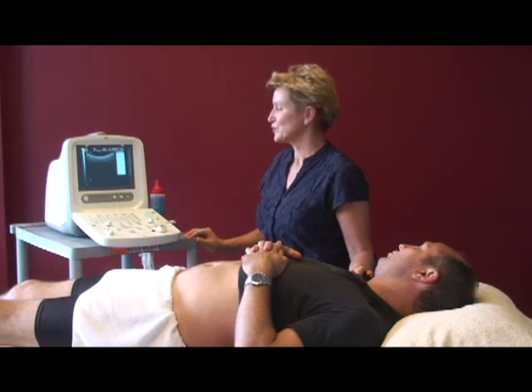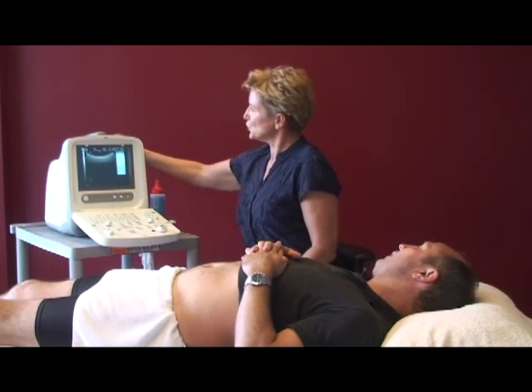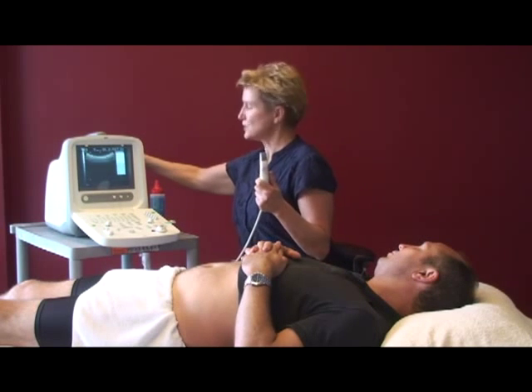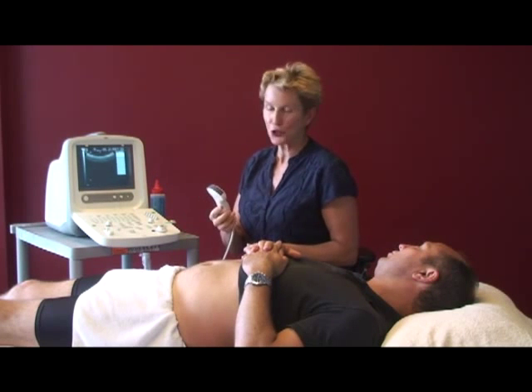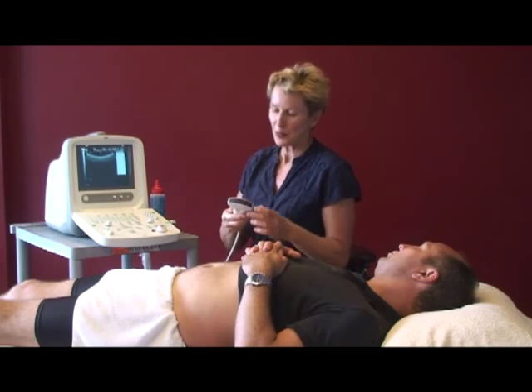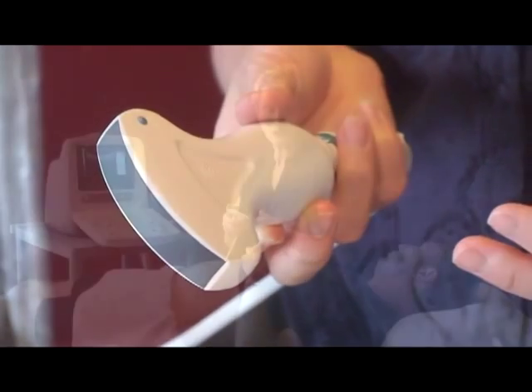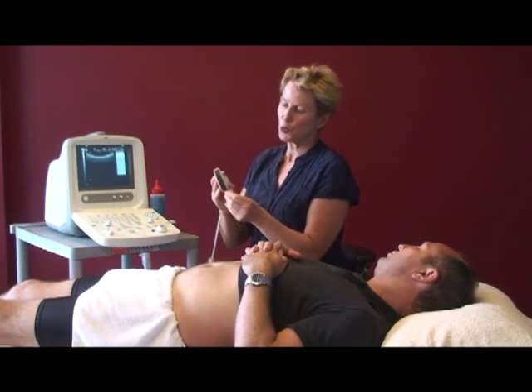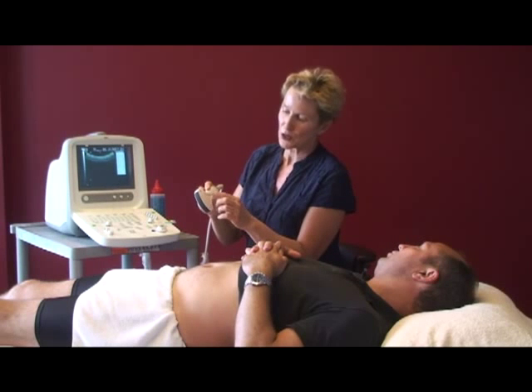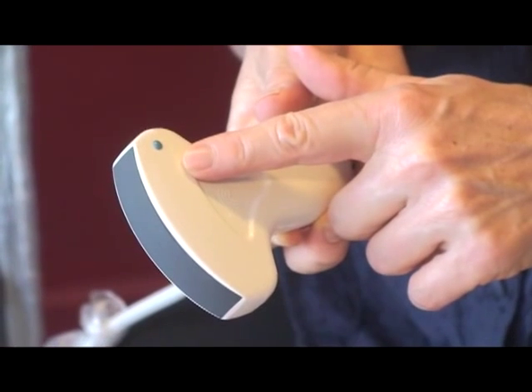Okay, the second thing, the machine itself. So firstly, you'll tend to have 2 transducers. The first one we call a curved array transducer, and its frequency tends to be lower, anywhere between 2.5 and 5 megahertz. And when you're using this, you also want to look for the dot, so that the client can see where you are.